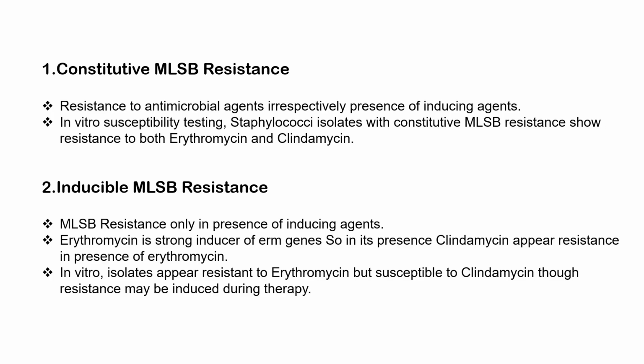There are two main types of MLSB resistance. First one is constitutive MLSB resistance. In this type, resistance is always present regardless of any inducing agent. During lab testing, bacteria show resistance to both erythromycin and clindamycin, so these antibiotics are ineffective in treatment.